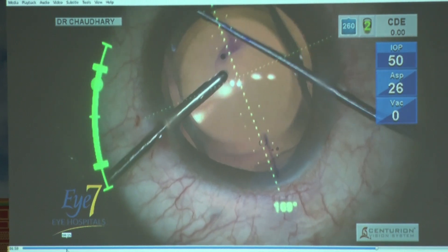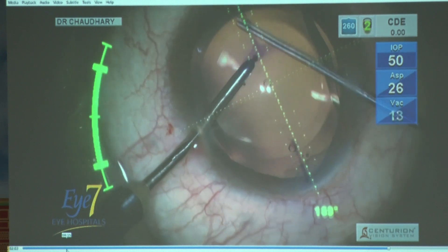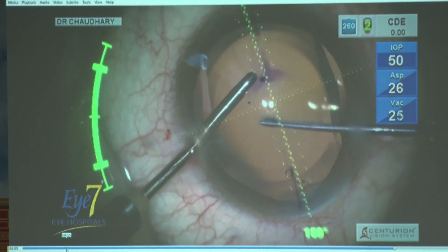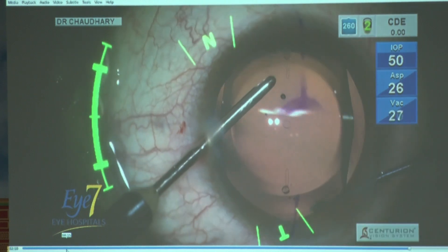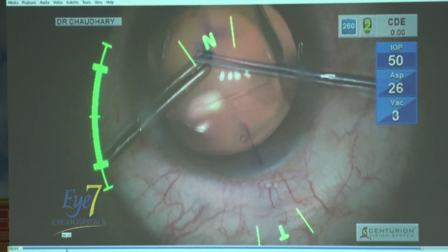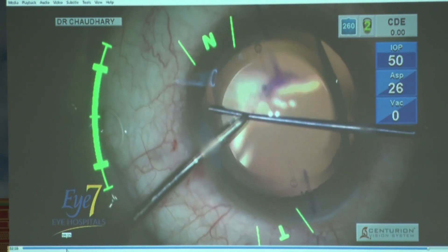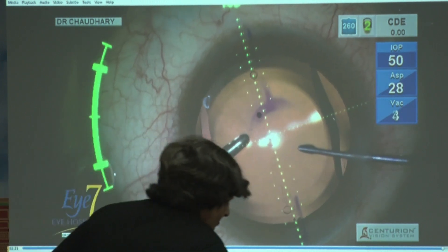Now I'm reassessing after the third haptic. If there are some adjustments to be made, it is easier to make them now rather than after all four haptics are inside and the lens has got a grip in the eye — moving the lens within the eye becomes a little difficult. You can best avoid it by being sure before you put in the fourth haptic. Then you check the axis, and if the axis is fine, the job is done.